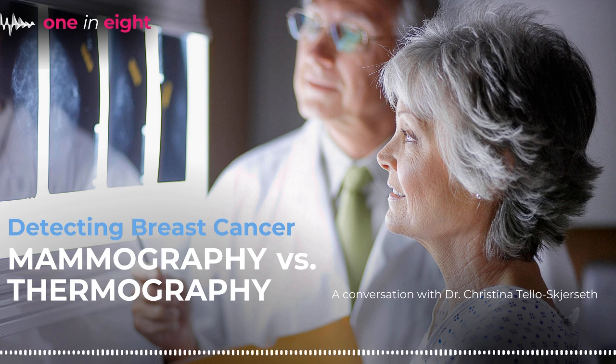And the theory behind that is that breast cancers are hypermetabolic, meaning they essentially take up more blood flow because the cancer is making more vessels, and it essentially eats more, if you want to think of it that way. So the thought process is that more vessels, more metabolism makes that area hotter. It gives off more heat, and then you can see that on your skin surface.